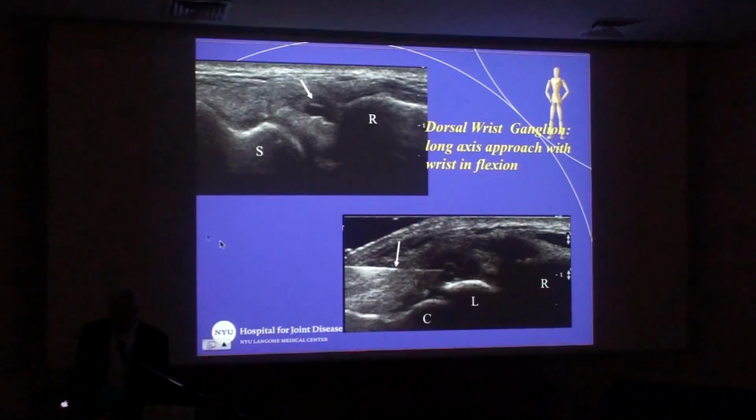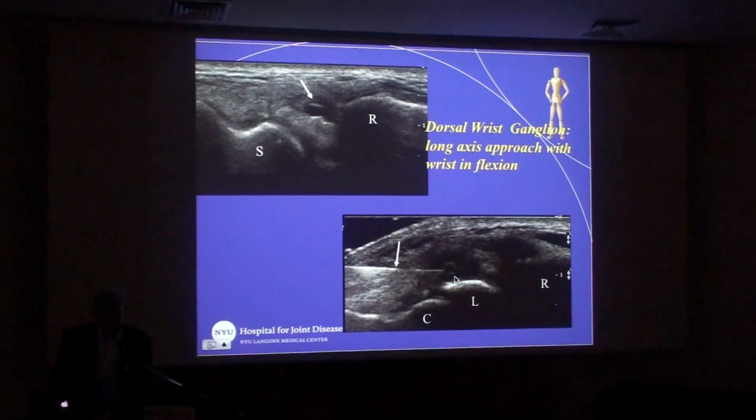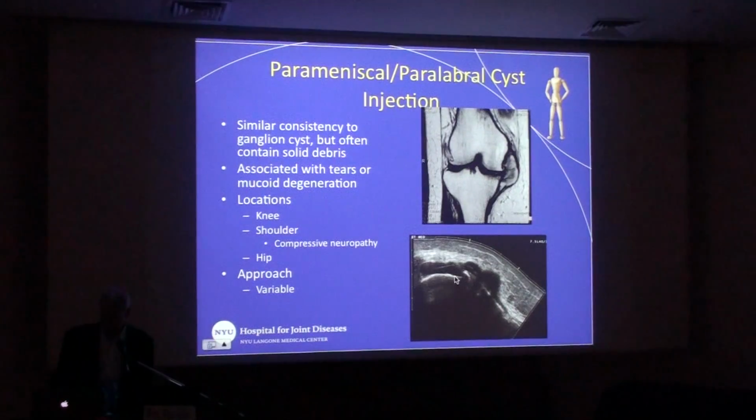You can see in the lower image over here, my needle going into the cyst as we're going to do an aspiration and injection. So again, it'd be hard to imagine doing this any other way than ultrasound.